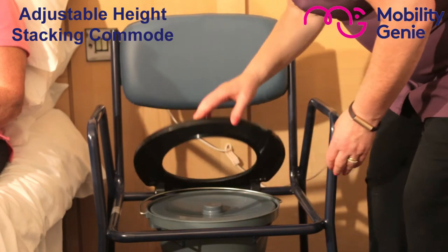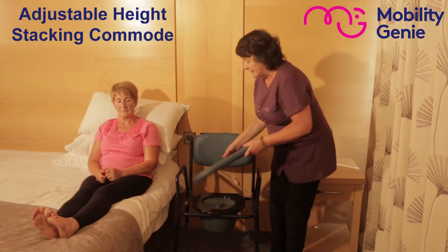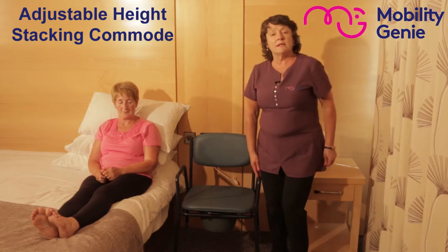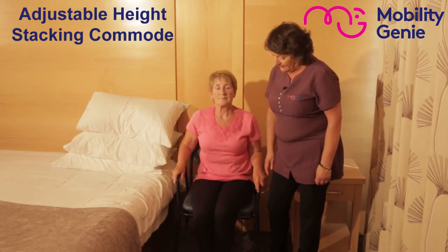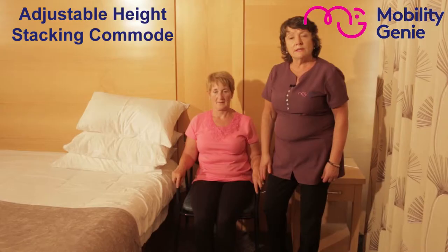For the purpose of the demonstration, I'm going to put the blue padded seat top back again, and Margaret is going to show that it's actually at the proper height for her. When she's sitting at the back with her two feet on the ground, she's comfortable, and it makes it easier for her getting on and off the commode.